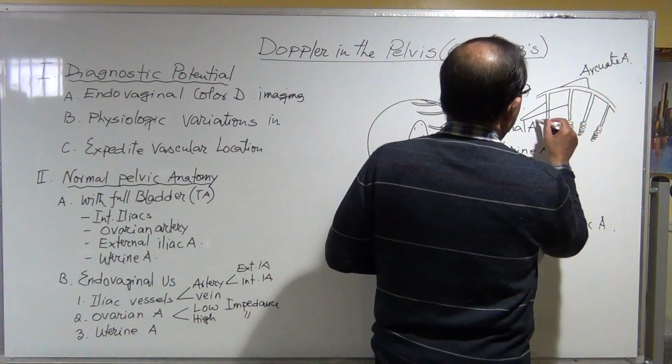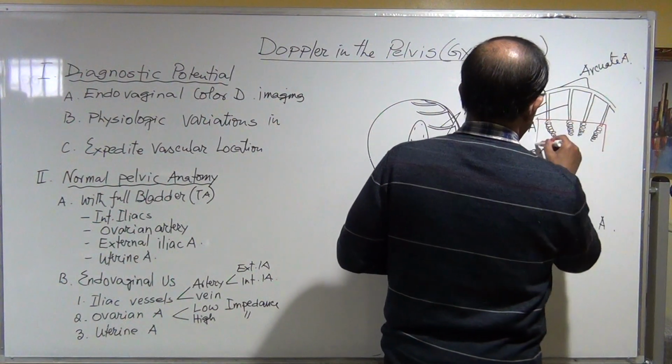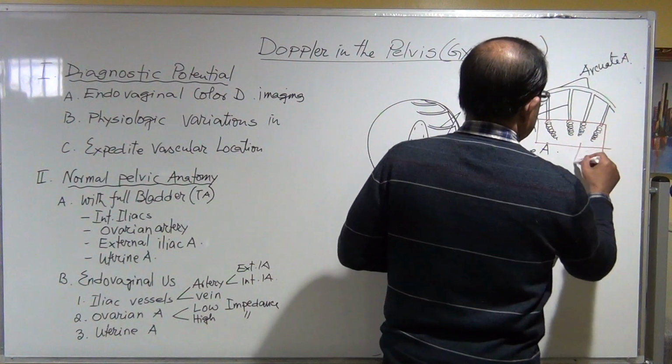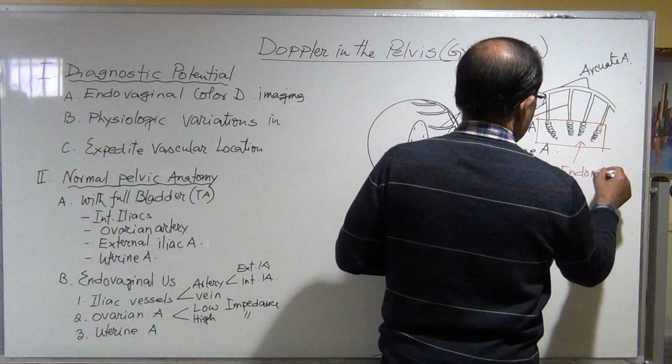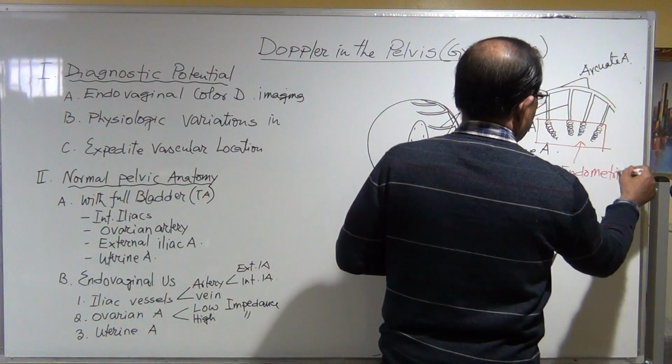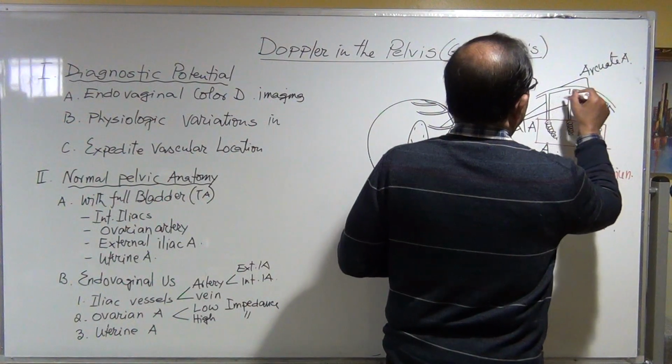So this part is the endometrium. And this part is in the myometrium.